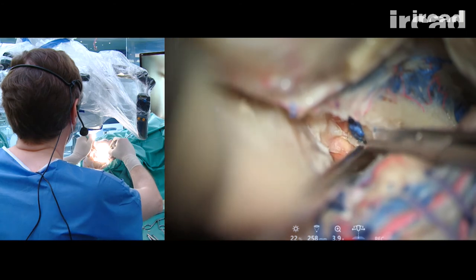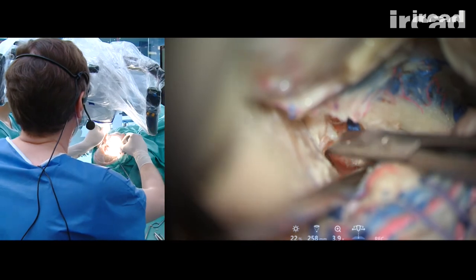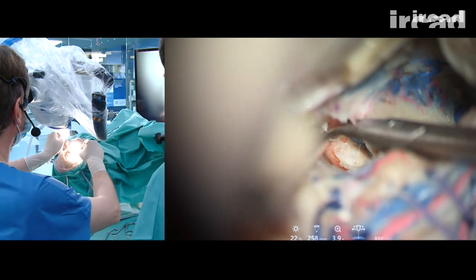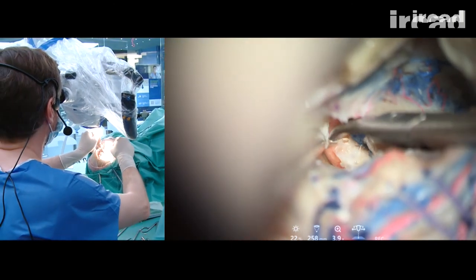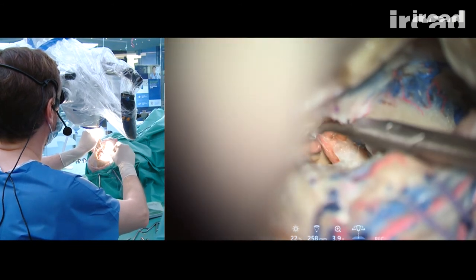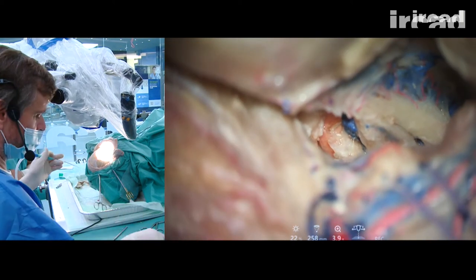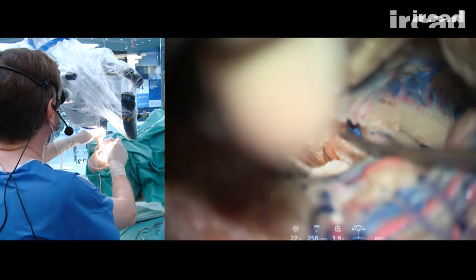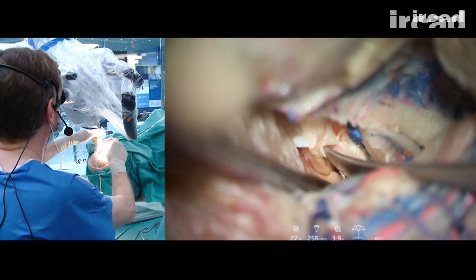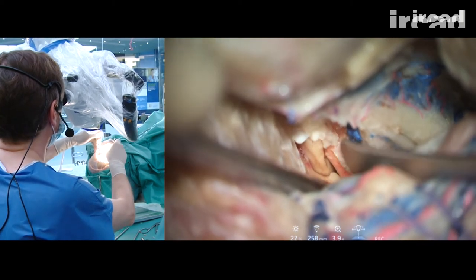I just recut the distal dural ring, which is the difficult part of the ring of the carotid artery to expose, because the ring is continuous with the adventitia of the vessel, so you have to be careful. We have optic nerve. I'm looking for ophthalmic artery. It is probably a little bit more anterior. Sometimes ophthalmic artery originates in the subarachnoid space, sometimes subdural, sometimes extradural. It's probably a very anterior origin of the ophthalmic artery. Optic nerve here.